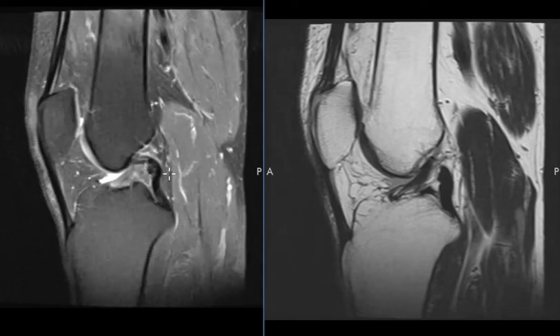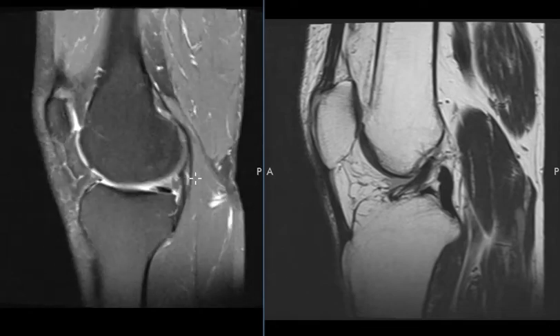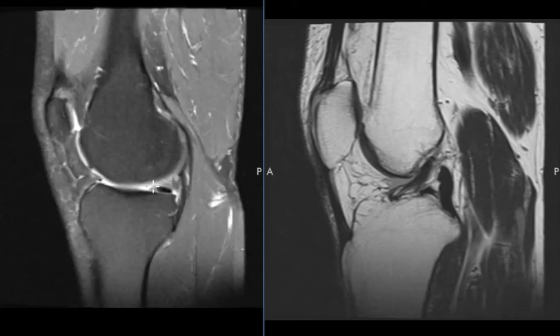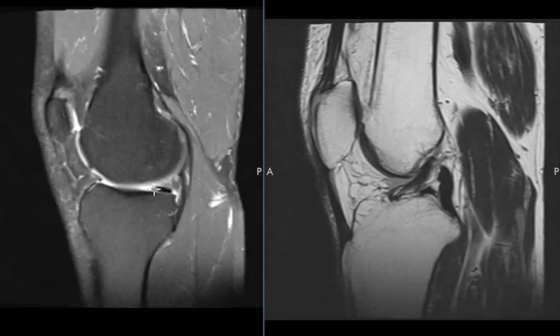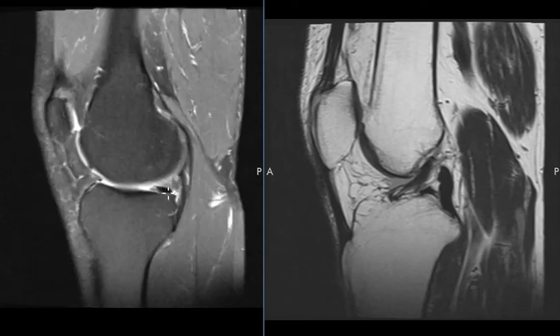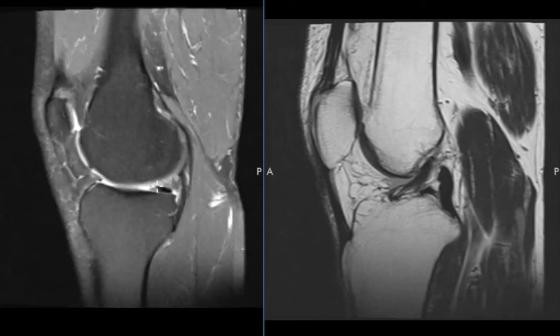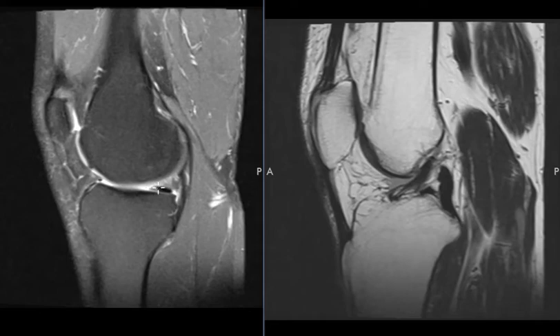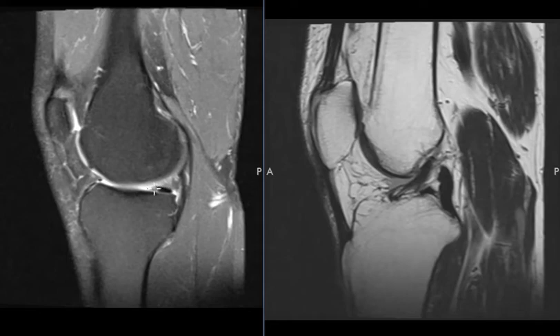We're going to go over to the medial side. There's a small meniscus tear along the inner margin. This is the meniscus — it should look nice and triangular, but instead it looks more flat and blunted.